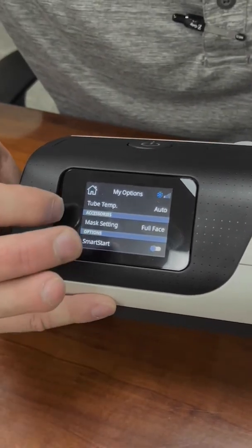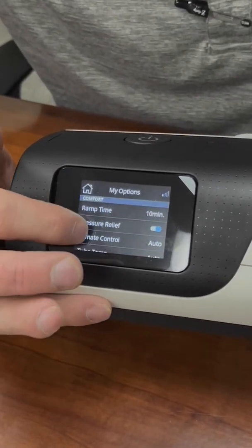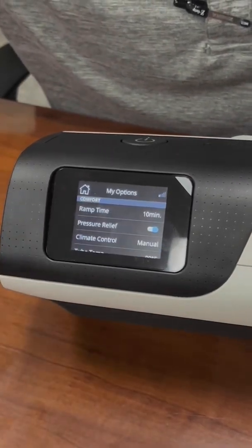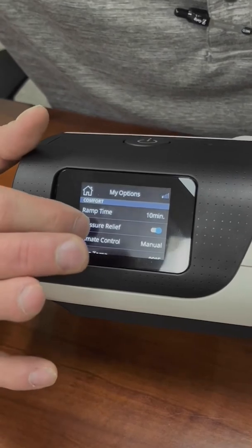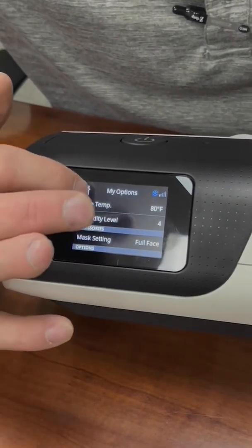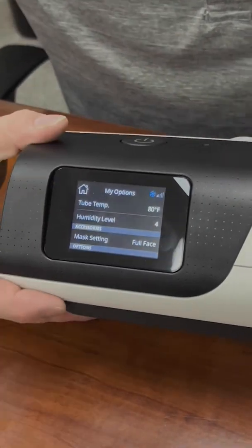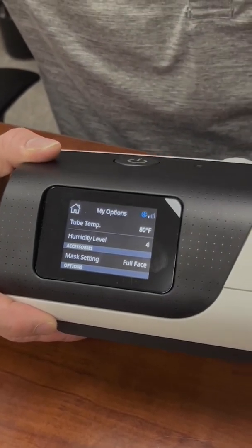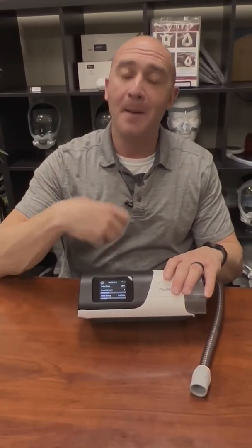But when we set this to manual, you now have two options that you can change. You'll notice below them there's tube temperature and humidity level. So essentially what humidity level is, is how hot this heating plate gets on the side. The hotter that gets, the faster the evaporation rate, so the more humidity you're breathing in. But you don't have that condensation protection like you do in auto. So it's a little tricky to get that dialed in.